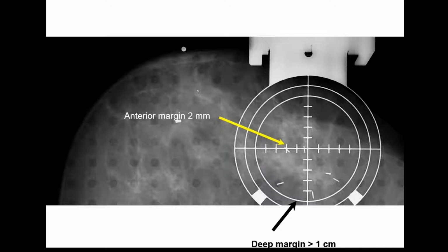So what we've done is weight the applicator placement not posteriorly but anteriorly, where we expect the greatest risk of residual disease burden to sit. So this is, again, with AccuBoost, a great advantage and a great application of the tool. Next slide.